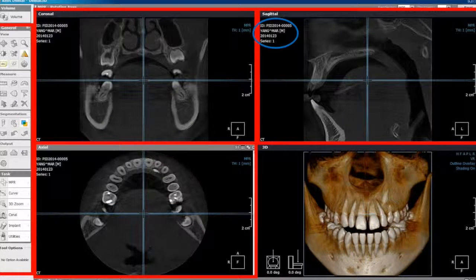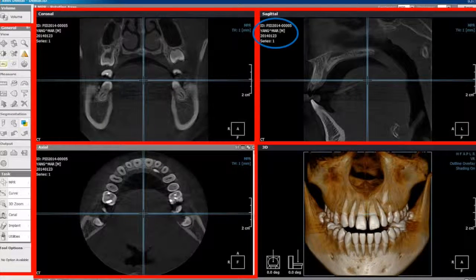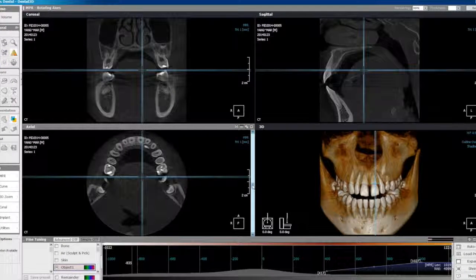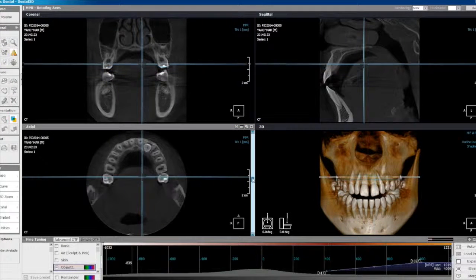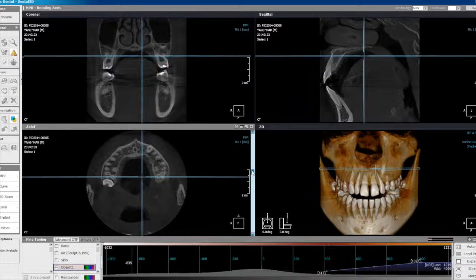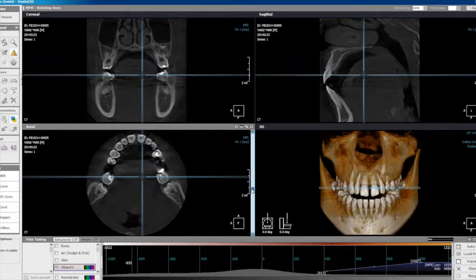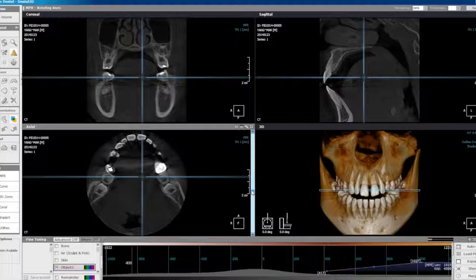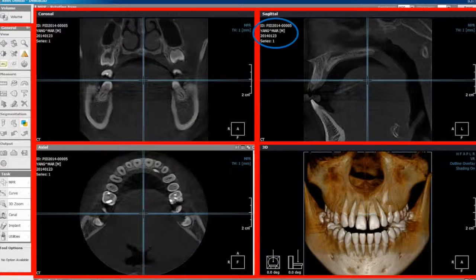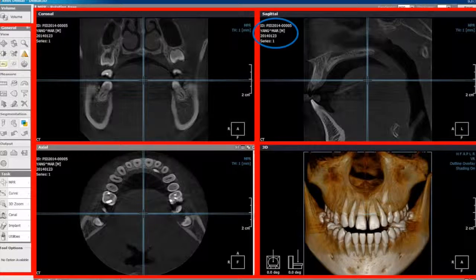Below the coronal view is the axial plane. Axial plane cuts through the anatomy parallel to the floor, separating the superior from the inferior. The view can be adjusted as previous. Finally, the 3D view displays a complete three-dimensional perspective.